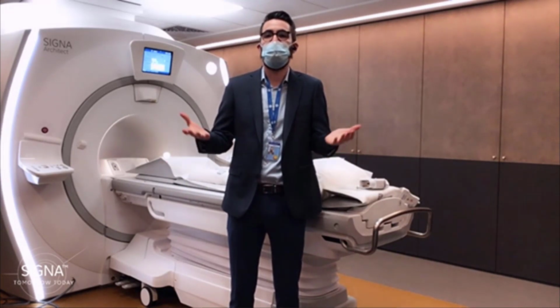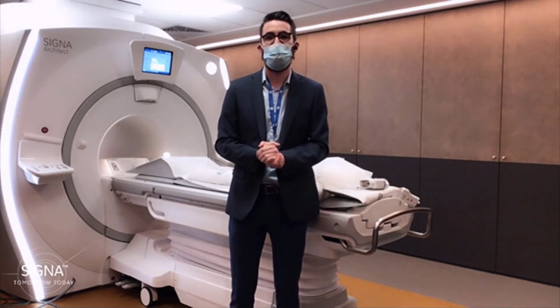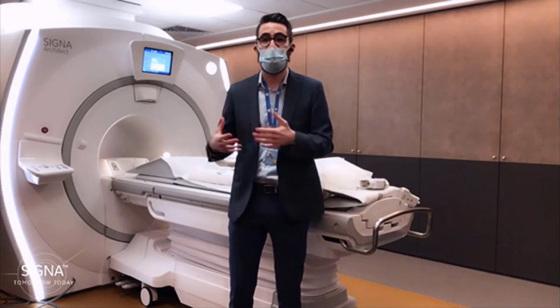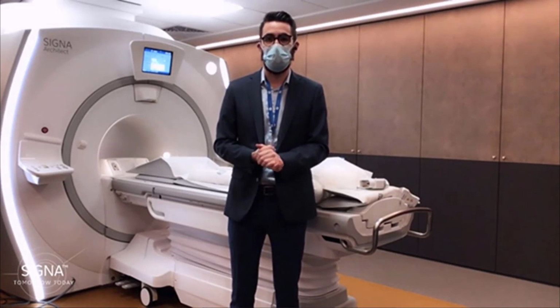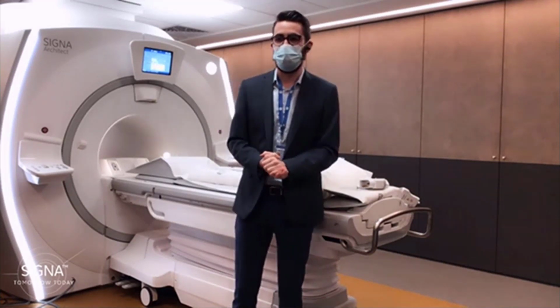We all know that there is a lot of interest in performing body MR. You have several contrasts, you have dynamic acquisition, but due to the MR technique or sometimes to the patient conditions, you still have some challenges to perform MR. So we really try to address them, and let's discover that this morning.